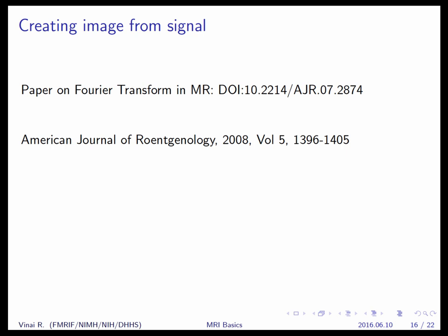But the subject will get heated during the scan? No, the RF isn't enough to heat the subject. When I say it changes the temperature, I mean things that induce heat. The RF is not like a microwave. It's only RF. It doesn't really heat the subject. A little bit, sometimes you might get a little bit of heating, but it's not that much.